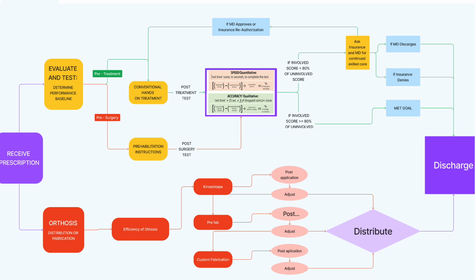In the first scenario, the patient is referred for evaluate and treat. Upon initial evaluation, the Corbett Targeted Coin Test is used for baseline measurement. Please follow the green line. In the event that the patient cannot meet participation criteria, simply state unable and describe their physical deficits.